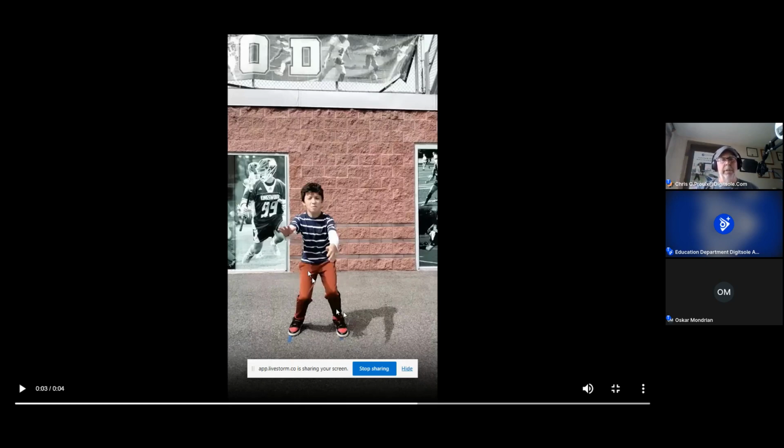But I think it's slightly obvious, and there has been some data showing, because there are some devices that simply use a mobile device to capture this information, and there is correlation to measuring dynamic knee valgus with a single camera. I will say, get good at your technique. There are better ways to do this. For example, you'll notice that I'm shooting straight on, but it looks like we're looking uphill. That's part of the distortion that happens as a result of your camera position, but also the distortion that we naturally see in those devices. The way that those cameras are designed is not a straight shoot like a normal camera.